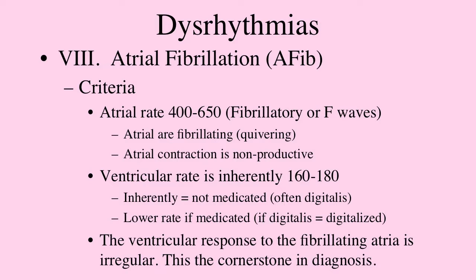The ventricular rate is inherently slower, but still fairly fast at 160 to 180. We'll get back to the medication for this and so forth. If you look at page 57, you see several examples of atrial fibrillation.